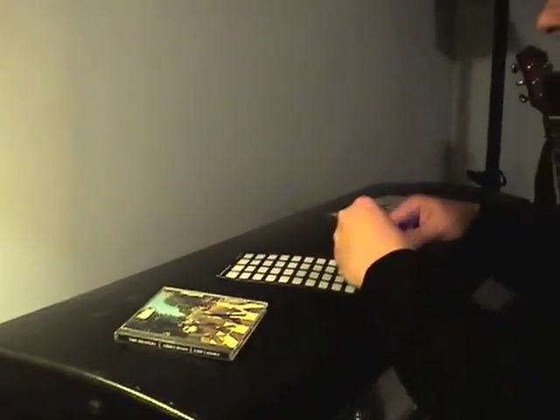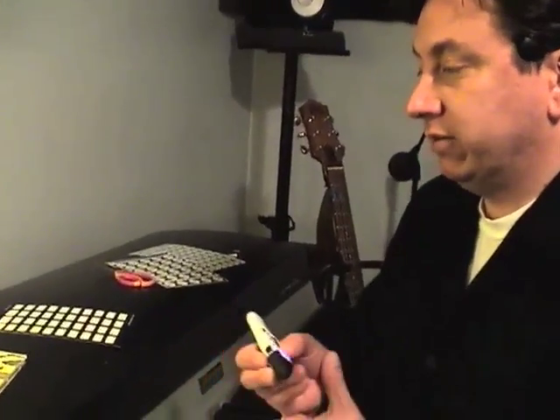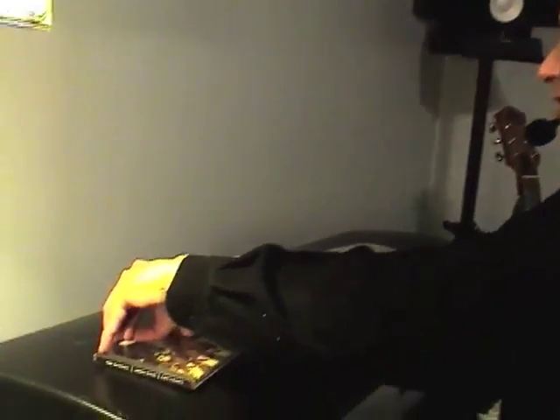I'm next going to take the Touch Memo, press and hold the record button, which is the button closest to the tip of the Touch Memo, and then point it at my label. Abbey Road, The Beatles, and then let go of the button. Now I can point at the label. Abbey Road, The Beatles. So next, for my little trick, I'm going to remove the label from the case.